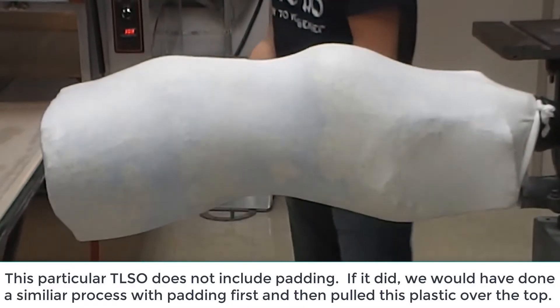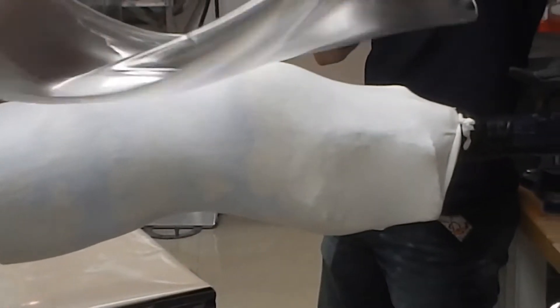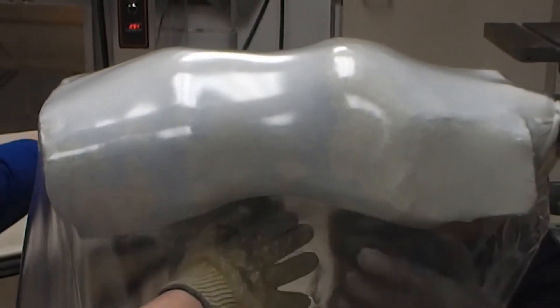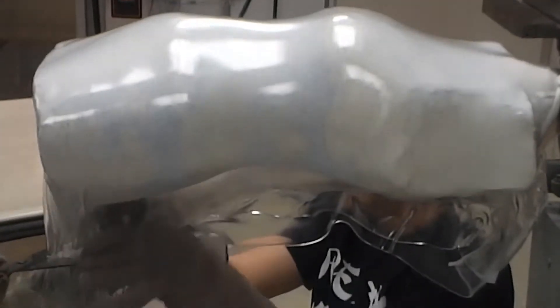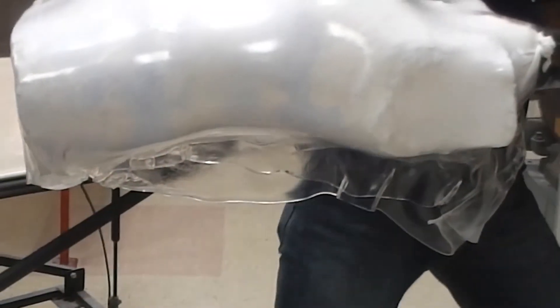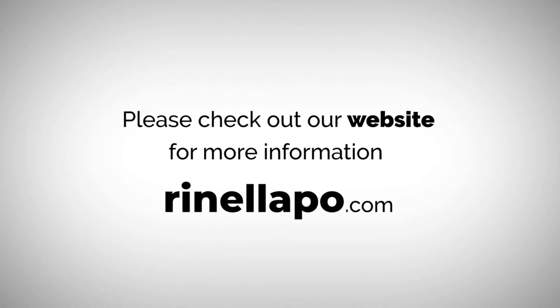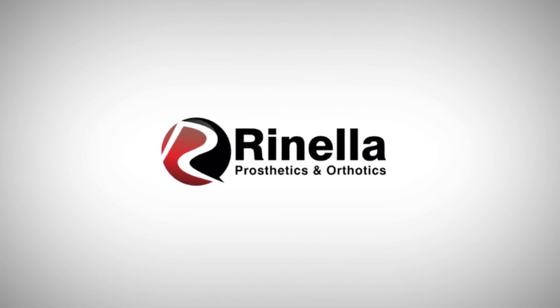Here it comes. The vacuum forming process begins, with the operator counting through the steps as the plastic is pulled over the TLSO cast.